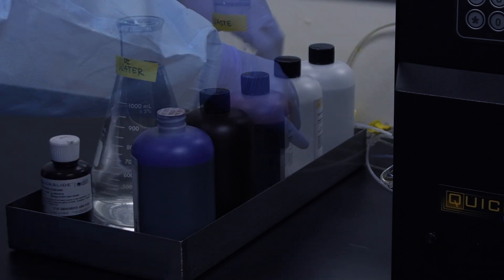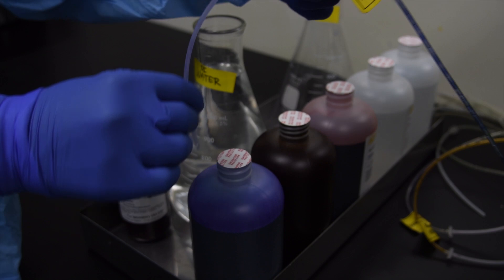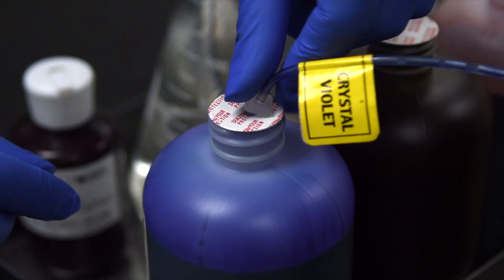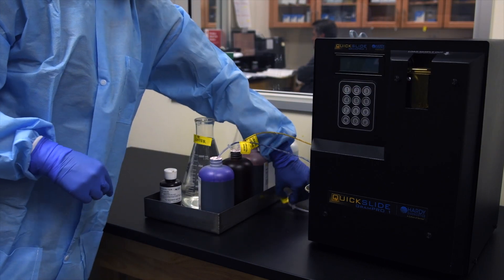Open the five reagent bottles. Insert the five labeled reagent cannulas into their respective bottles. Make sure the reagent pack is positioned directly to the left of the machine.